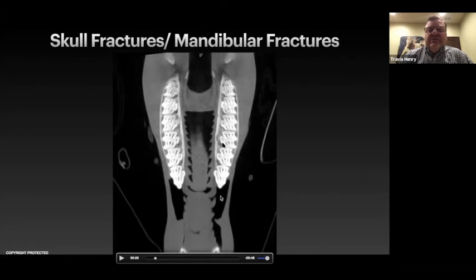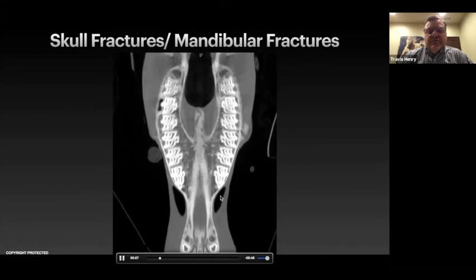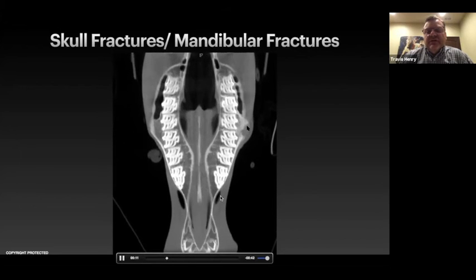Radiographically, the teeth looked decent, but we were still just trying to figure out on a dorsal ventral projection, I thought I could see something that looked enlarged along the facial crest. And so I was presuming that there was some type of facial fracture there. So we performed a CT on this horse, and I want you to watch very carefully what happens along this facial crest. So when we stop right here, we can see that there's a sequestra laying right there.